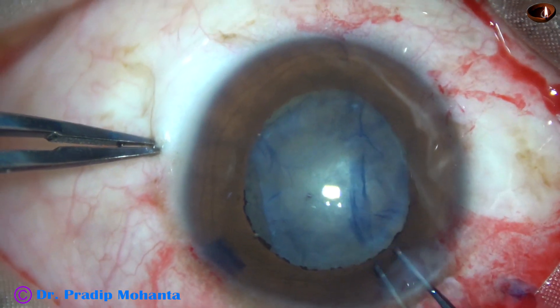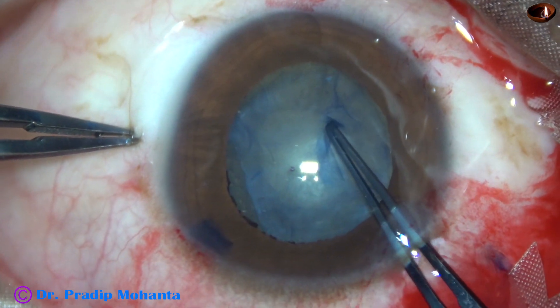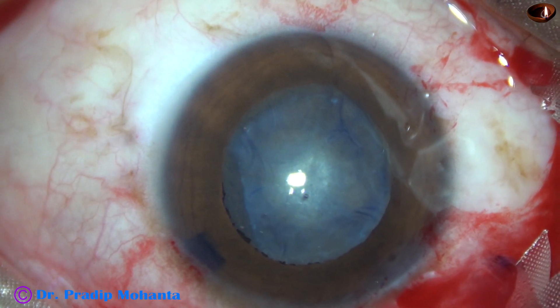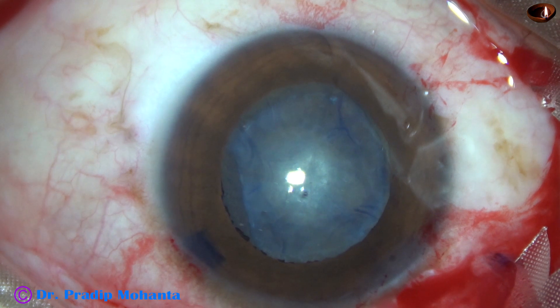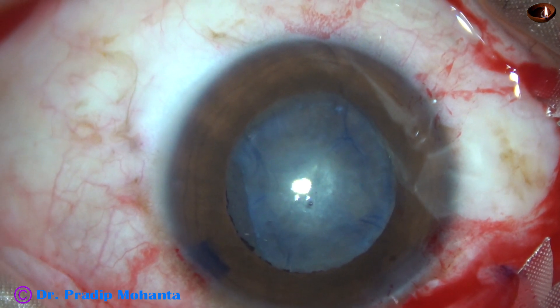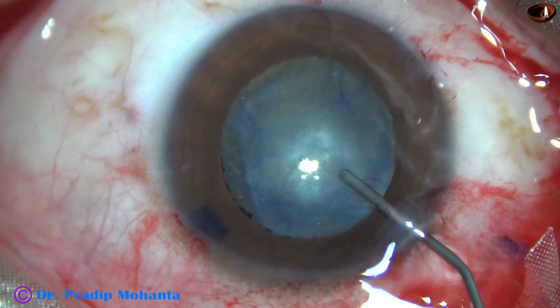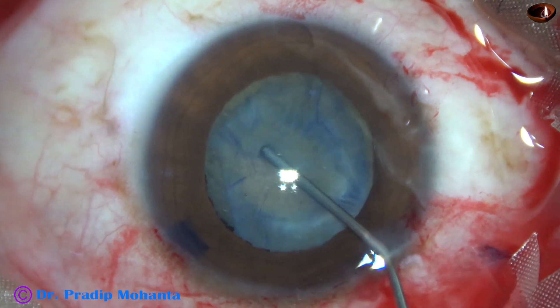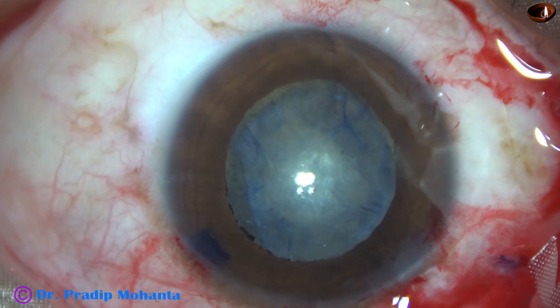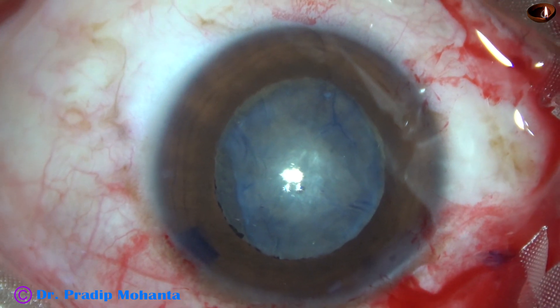Trying to do this rexis but probably this is small and not good — I have to make a larger rexis. The fibrous tissue is so tough and it is still attached all around to the anterior capsule.